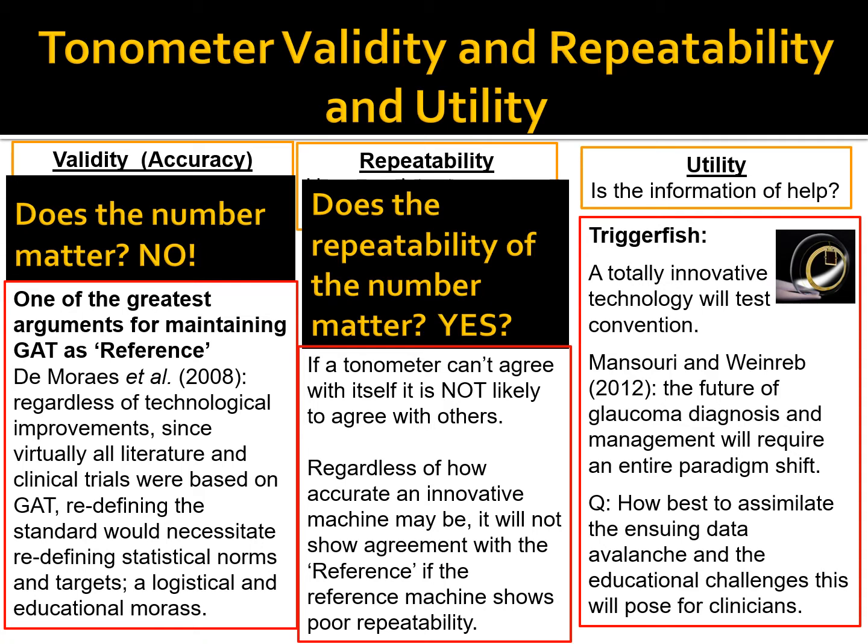But these two authors say the future of glaucoma diagnosis and management will require an entire paradigm shift. They suggest, how are we going to ever assimilate the ensuing data avalanche, and how do we cope with the educational challenges that this will pose clinicians? This is a serious question. This technology is out there, but how on earth are we going to assimilate it when we're so used to 80 years of single readings.